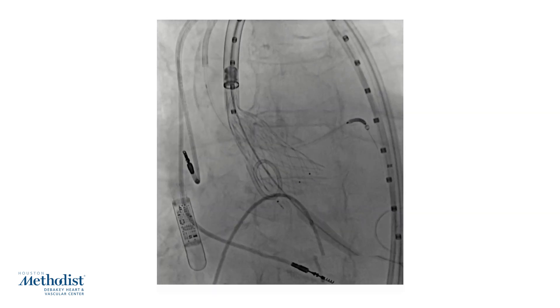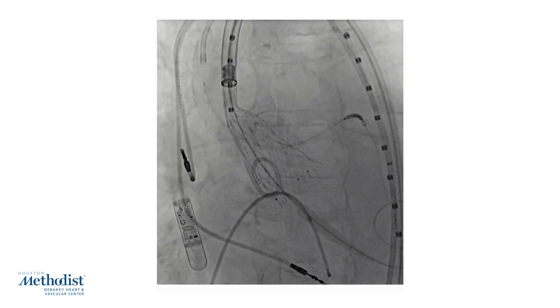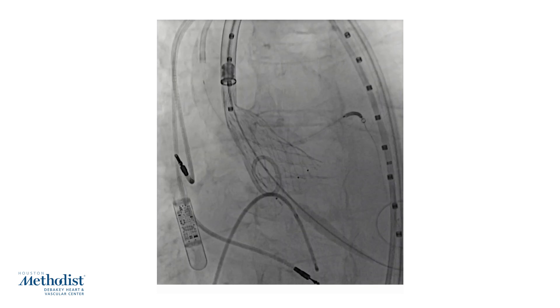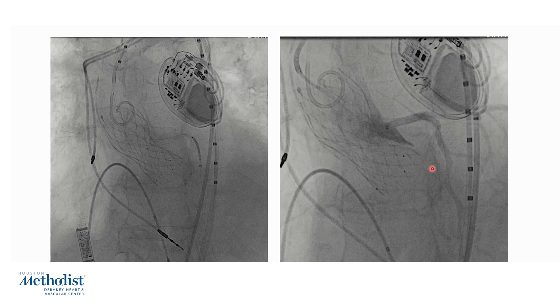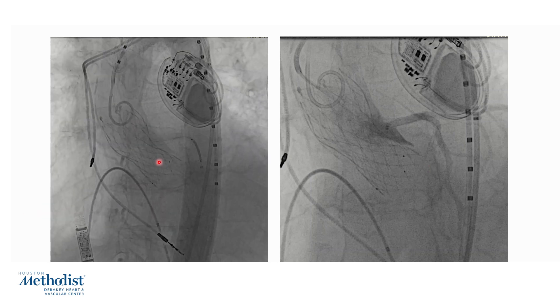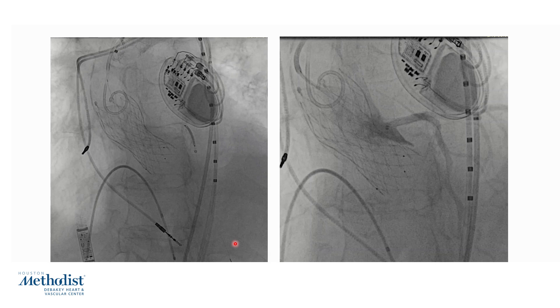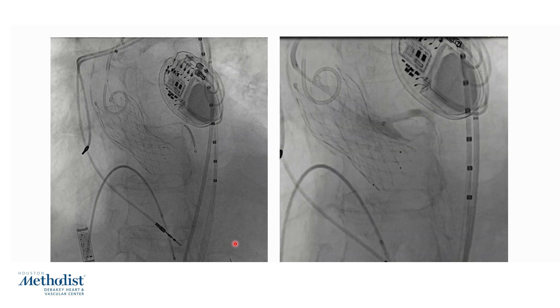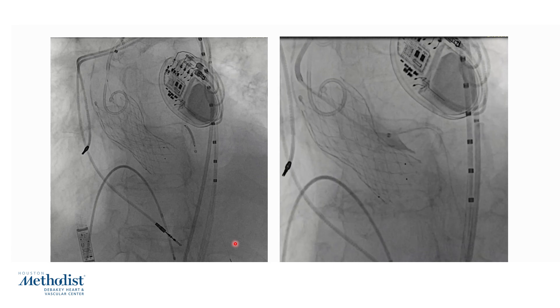We switch the C-arm gantry to the LAO view, and again at 80% deployment there is good positioning, good depth, three millimeters on the left coronary side, and good flow in the coronary artery with the guideliner and the stent parked in the proximal LAD. Subsequently, the valve is deployed uneventfully. The final aortic root angiogram shows excellent positioning of the valve, no aortic regurgitation, and good coronary flow. The stent is not needed and is retrieved back into the guideliner. By placing the guideliner tip just outside the left coronary ostium, we do an angiogram demonstrating good flow in the left coronary without any evidence of coronary compromise.